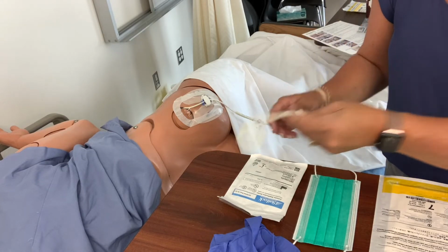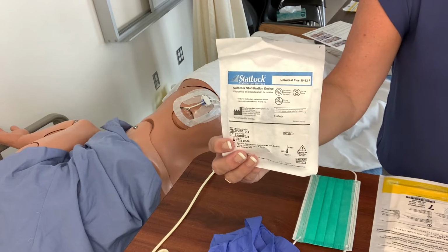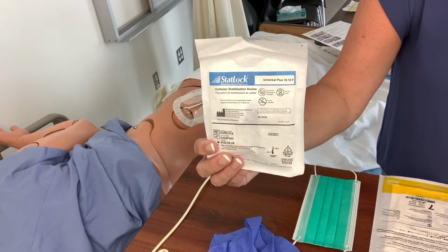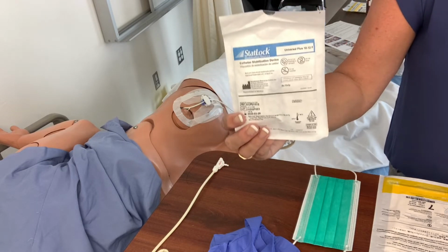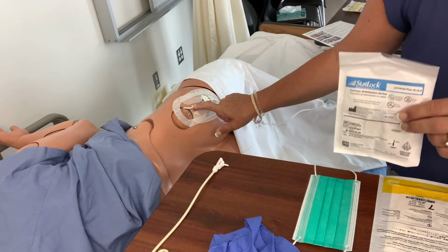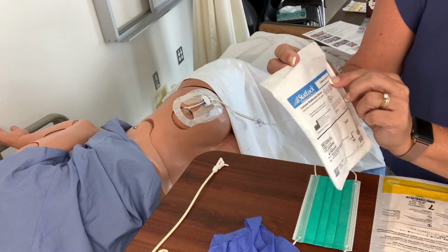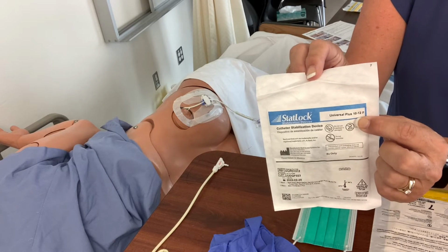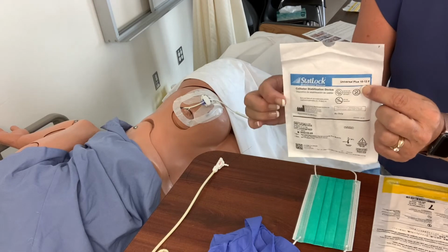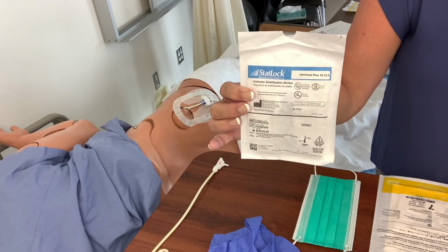In order for it not to get tugged, we're going to use a stat lock device. This is not the same stat lock device that we use for catheters. This is a different one, and there are different sizes. The pigtail that is in my patient right now is a 10-12, so my stat lock up in the corner is a universal 10-12. Your pigtail and your stat lock have to match, but it is not the same stat lock as a catheter.